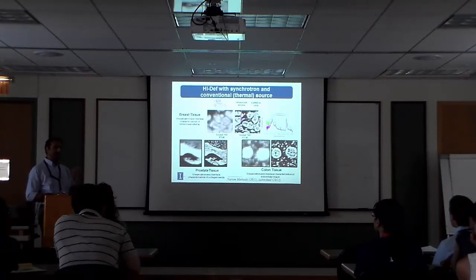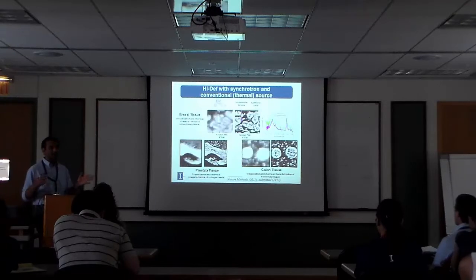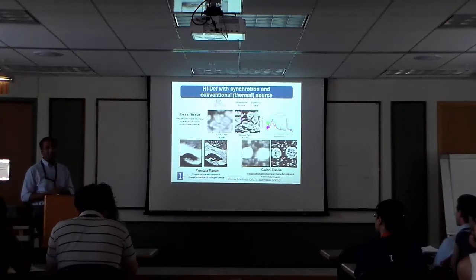So it turns out in chemical imaging, or in infrared microscopy, the wavelength's longer, but the quality of data, the 1 micron pixel, is precisely the sort of right pixel size you need in pathology. You need about 300 nanometer to a micron resolution. That's very sufficient for most things. It's 100x. When people say 100x, that's what they really mean, that kind of resolution. So it turns out we can actually get that information now using wavelengths that are much longer. This is very counterintuitive in some ways.